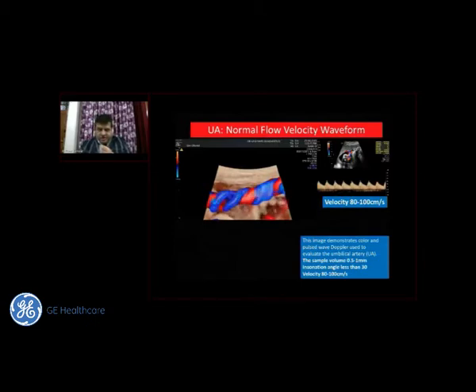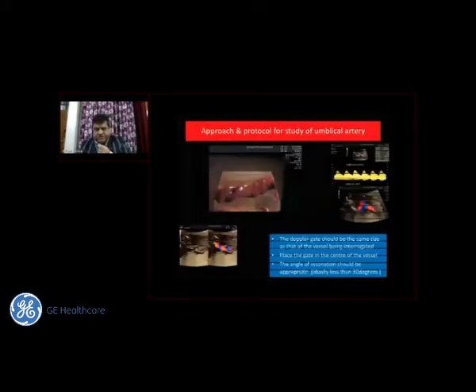The sample volume, for instance, is 0.5 to 1 millimeters. Insonation angle, again, is good. It is less than 30 degrees. We can talk about insonation angles when we are talking in the panel discussions also, and velocities should be appropriate.